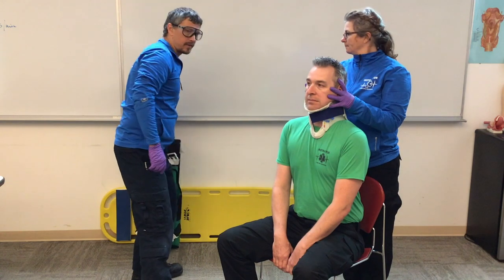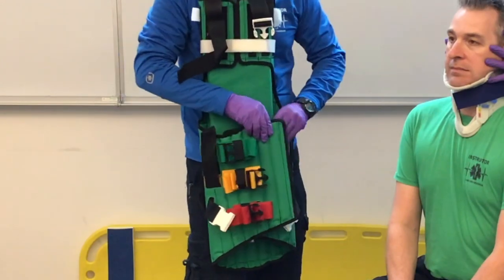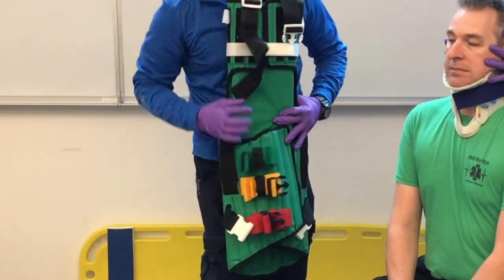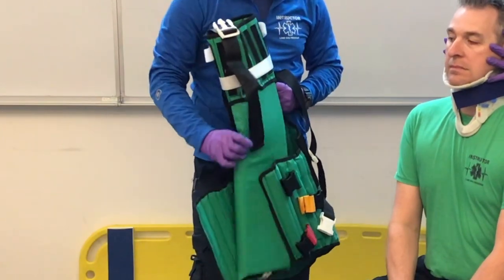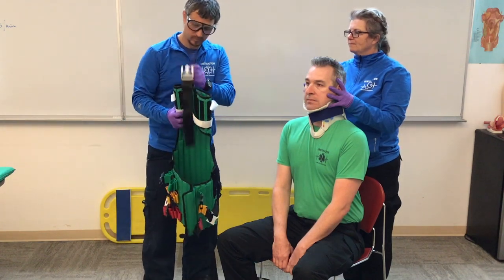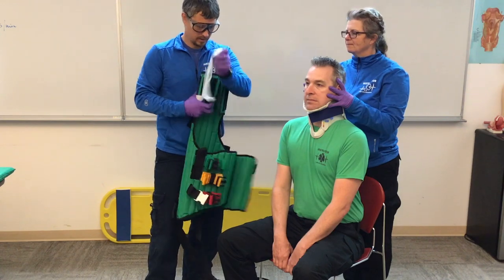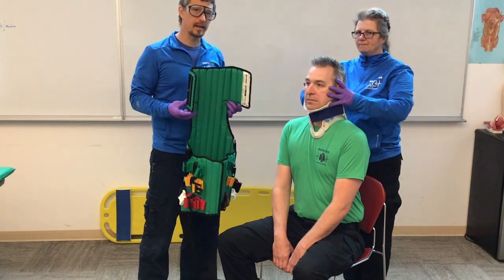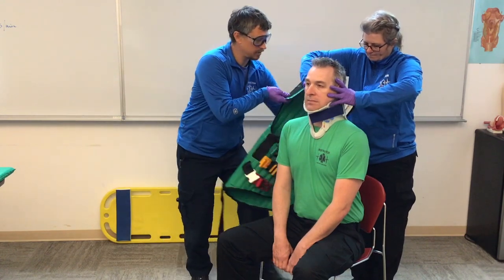Now I'm ready for the seated backboard. The KED has three straps in the center, two straps that go around the legs, and it comes with padding if needed. We'll set the padding aside for now, remove the head straps and set those aside, then put this behind our patient. I'm going to slide this in behind Chandler and right up through Cindy's arms.